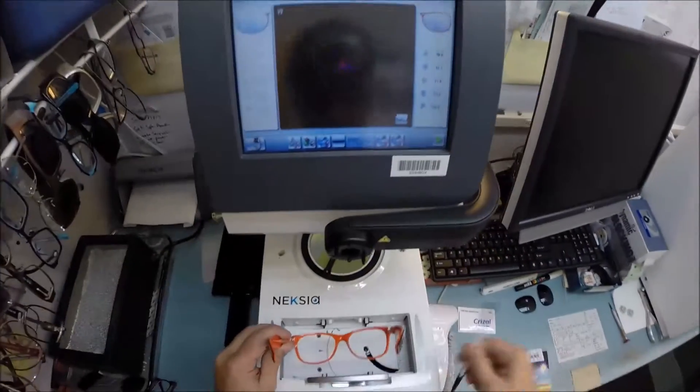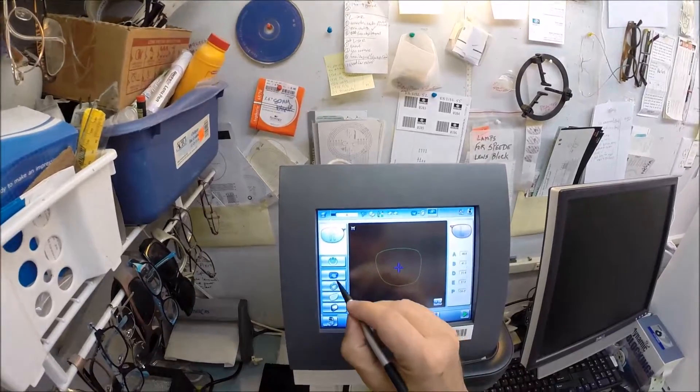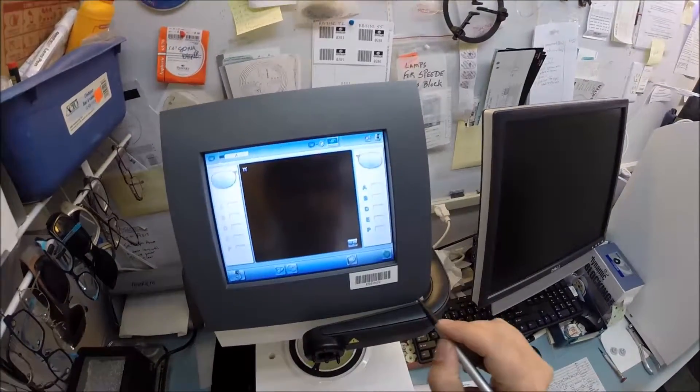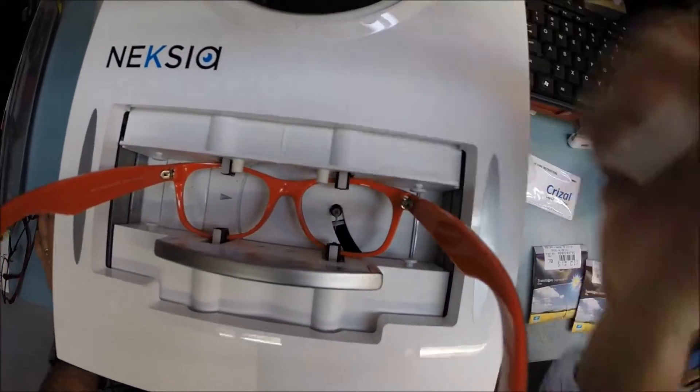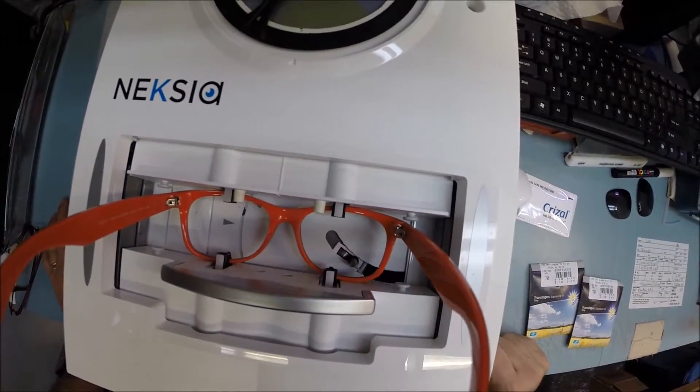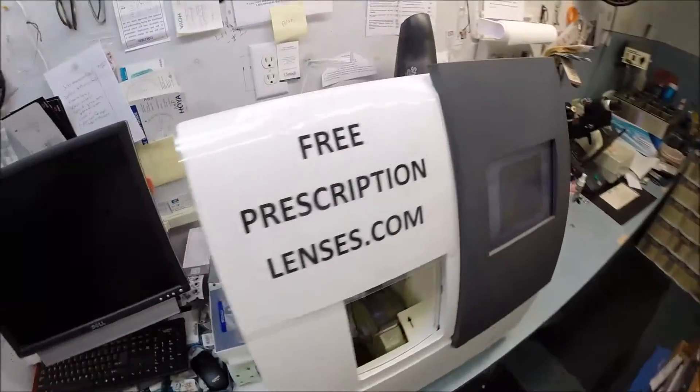Now I'm going to put this size 55 frame into the tracing element of my edger. We're going to hit the trace button. The stylus is going to pop up and trace the shape of the right side of the frame before moving over and tracing the left.